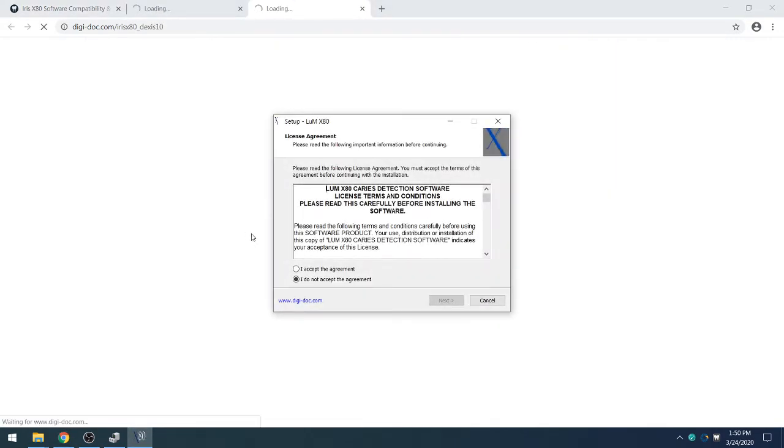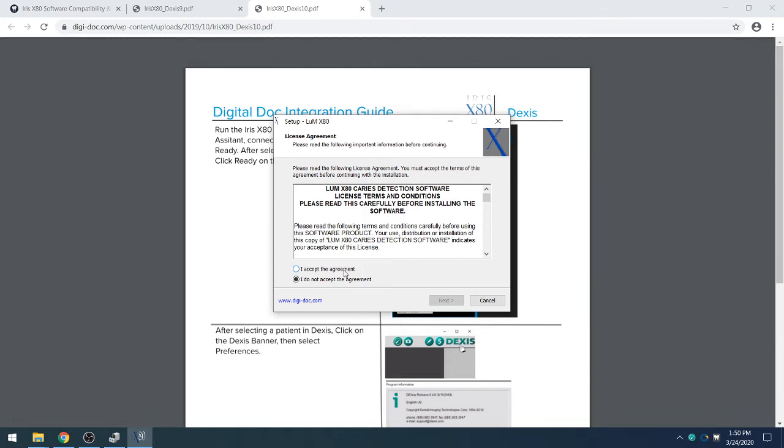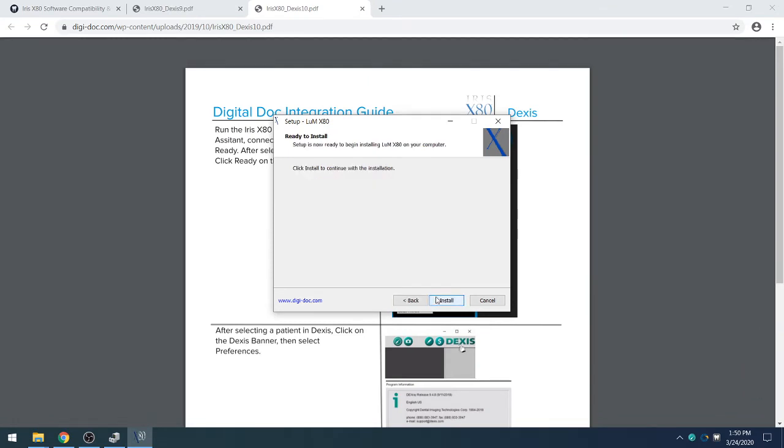That will then bring up the setup for the Lume X80, at which point we will select I Accept the Agreement and Next, and then Install.